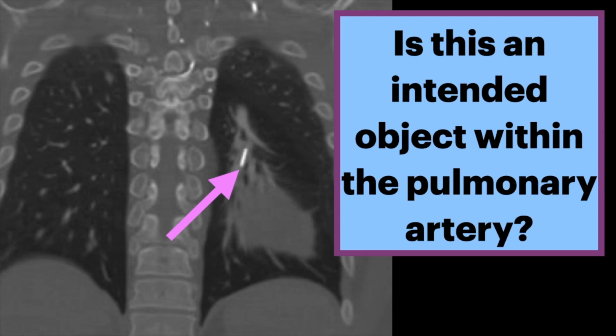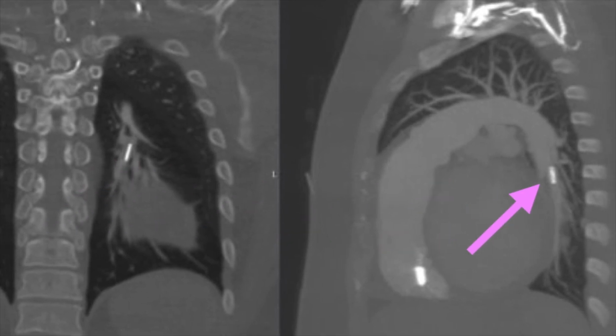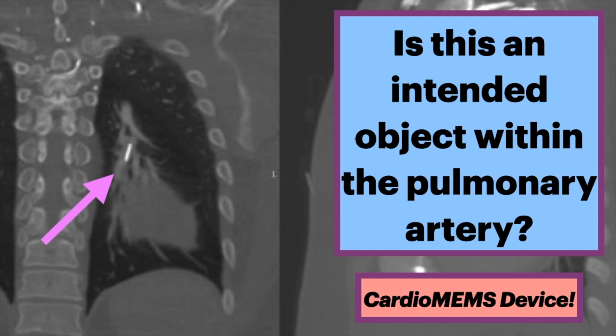Is this an intended object within the pulmonary artery? We see an approximately 2 centimeter metallic structure with a linear shape in a left lower lobe pulmonary artery. This is how it looks in the sagittal plane. This is a CardioMEMS device.